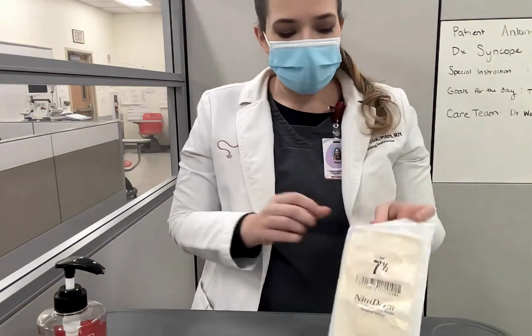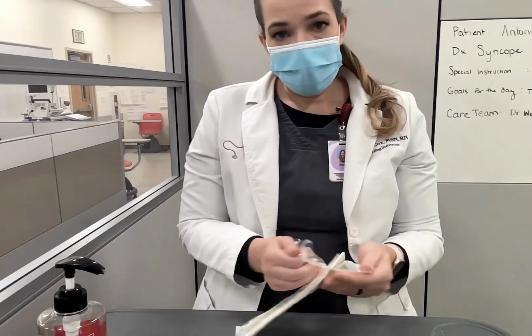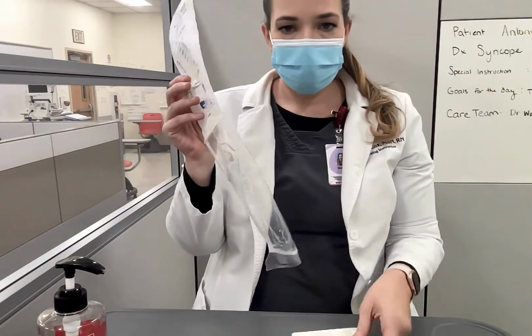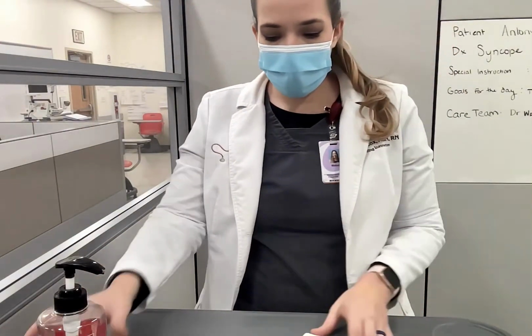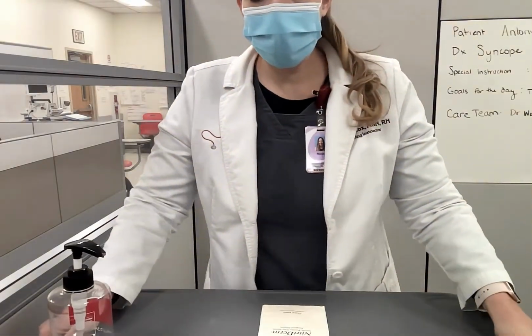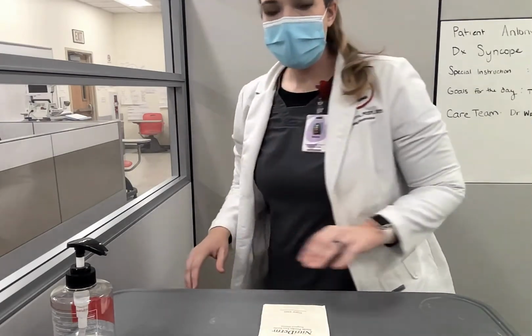I'm inspecting the package, opening it. If I see condensation in there, throw it away. If there's mold growing in a corner, throw it away, and that's very weird. Take your empty package, set it away. Have a clear space for you to do this. As you saw, I had to adjust the table to your height, your waist, or above.